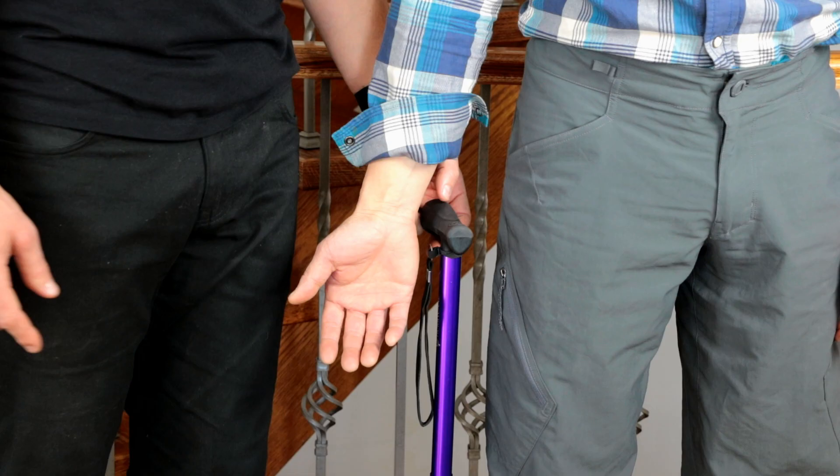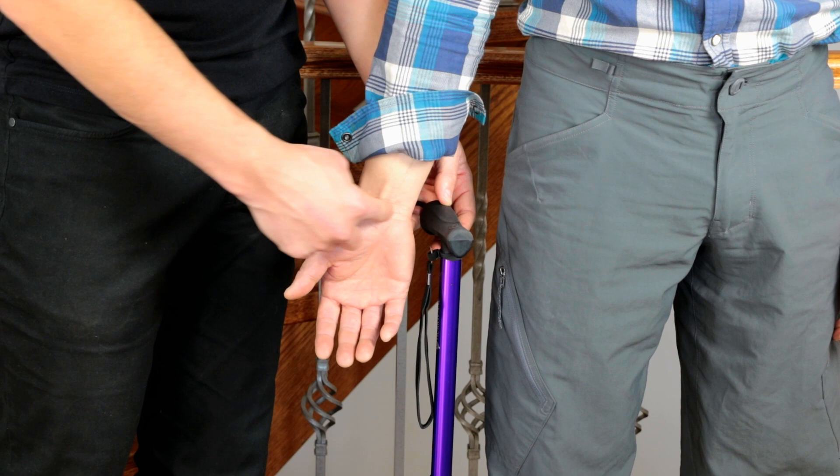The first thing to consider is that your cane is adjusted to the appropriate height. The handle of your cane should line up with the crease between your hand and forearm.